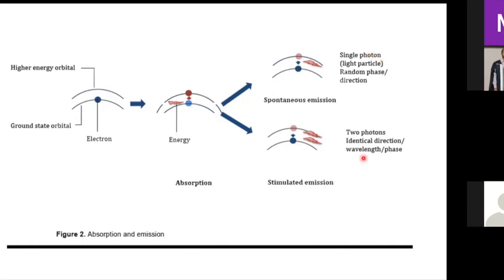But now, with a continued energy source, this photon that is emitted will further activate other atoms. And when that happens, that atom will emit two more photons. That is our stimulated emission. And then population inversion simply means that now there'll be more electrons in the active state as compared to electrons in the ground state. And this is only sustainable when there's a continuous source of energy.